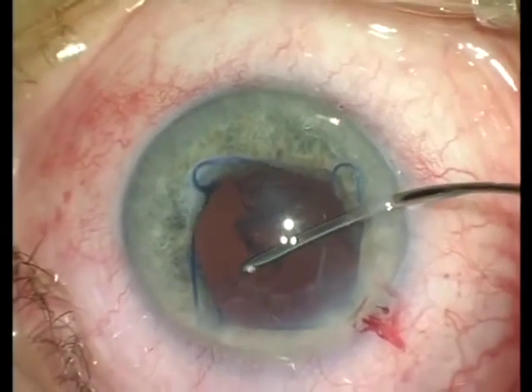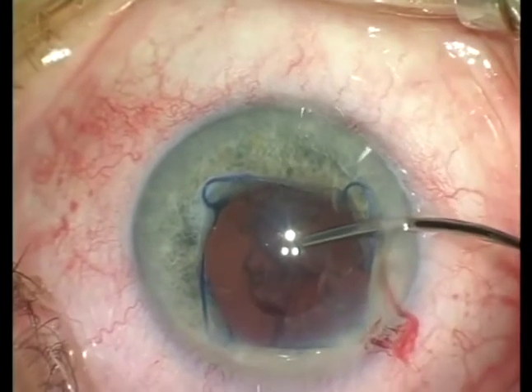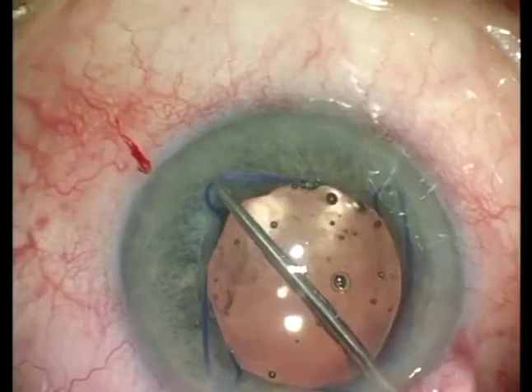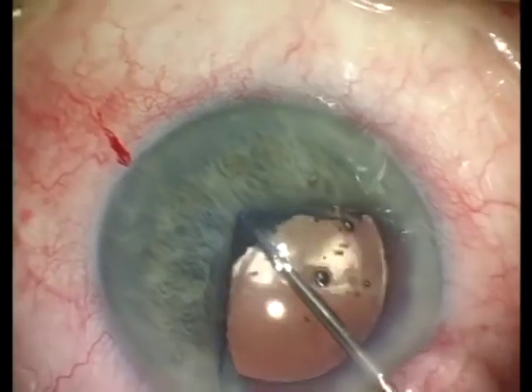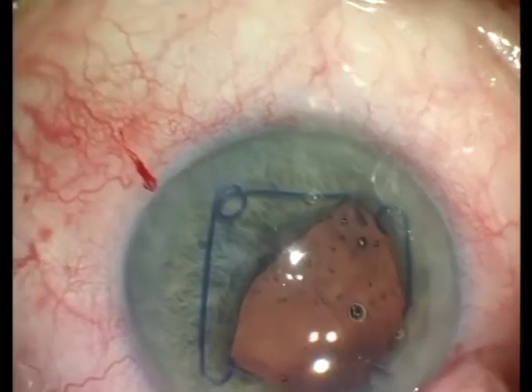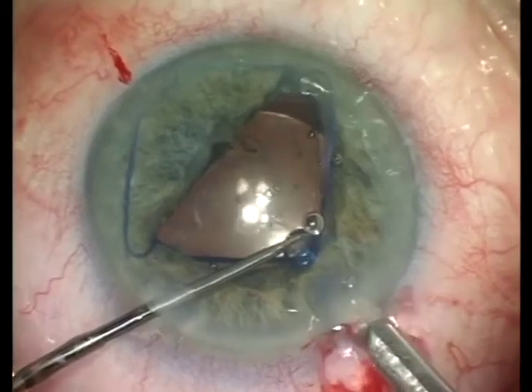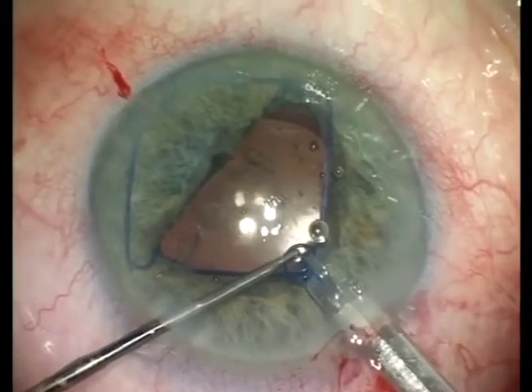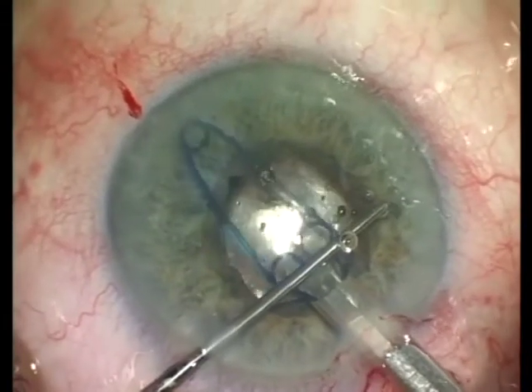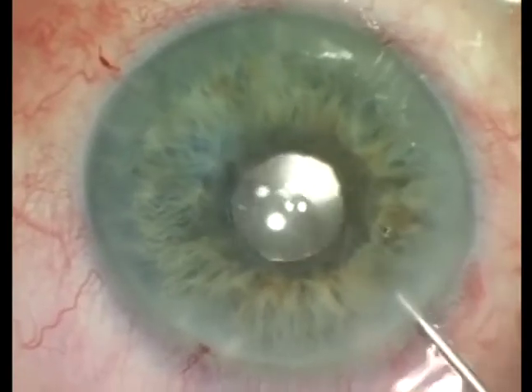Now, when the pupil is expanded and the cortex material is exposed, it is quite easy to aspirate it utilizing any of your preferred techniques. Following the IOL implantation, the device is removed from the eye with the help of the injection device, as shown on this video fragment. And this is basically the end of that case, which was finished successfully.